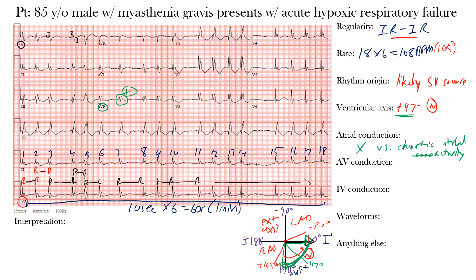Moving on to atrioventricular or AV conduction: again, we have no clear P waves, so there's no clear PR interval and therefore no clear AV nodal conduction. Remember, the PR interval runs from the beginning of the P wave to the beginning of the QRS complex — without a visible P wave, we cannot assess a PR interval.